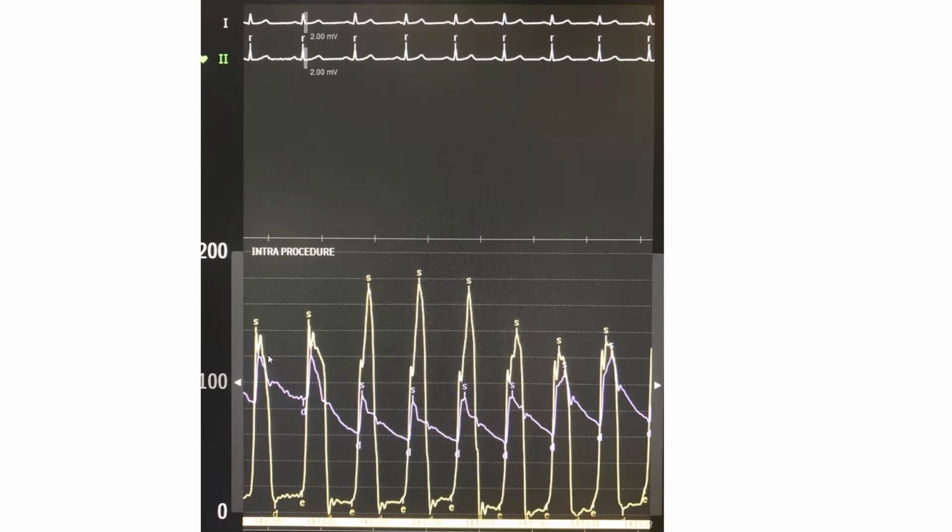So here we observe a patient. Here he did not have much of a gradient, but just spontaneously he started to develop a gradient. Those spontaneous variations in gradient support dynamic LVOT obstruction. It varies with breathing and wakefulness or strain. And the more you have obstruction, the more obvious the morphology. Note, it's not just a dynamic gradient, it's dynamic morphology.